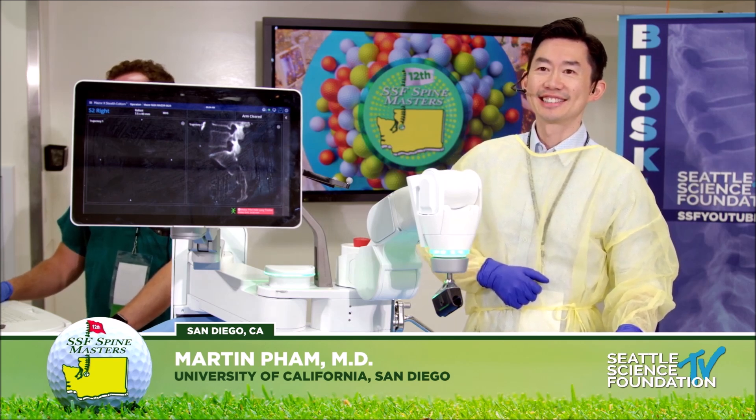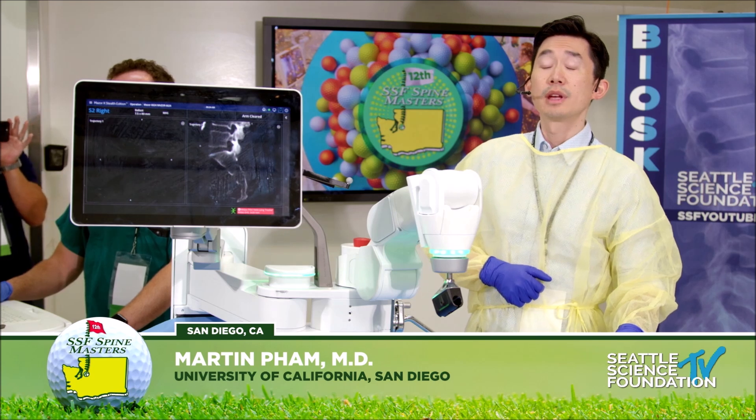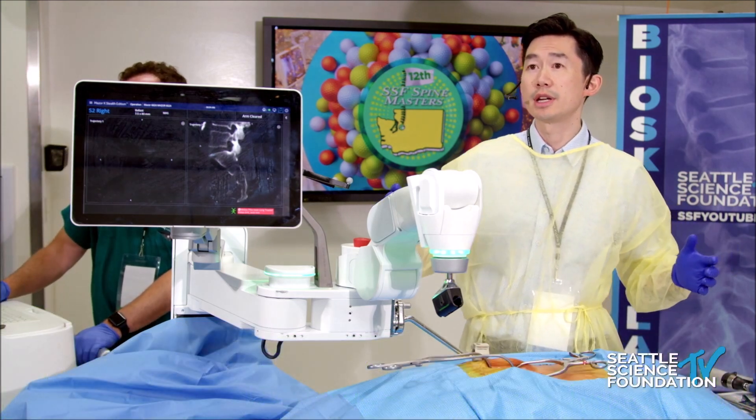So, Martin, you're going to demonstrate a robotically placed sacroiliac or pelvic screw. Yeah, so I believe for this demonstration, it's going to be demonstrating S2ALI iliac screw placement, especially in the setting of deformity.